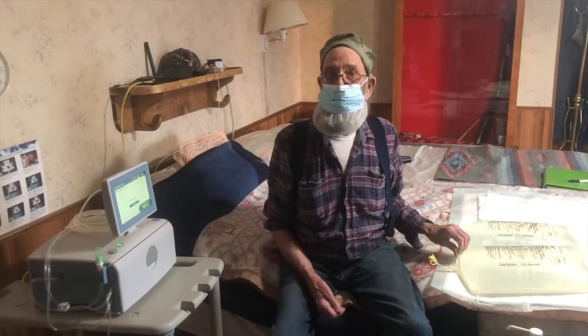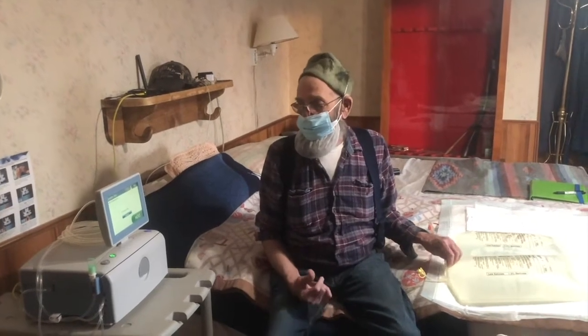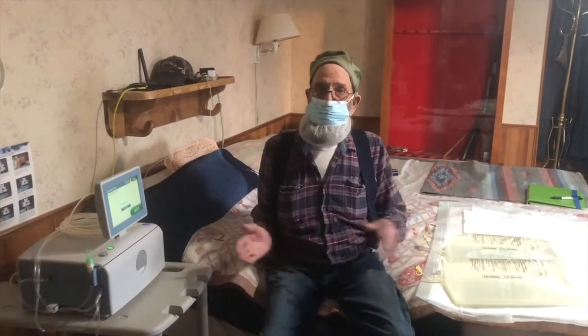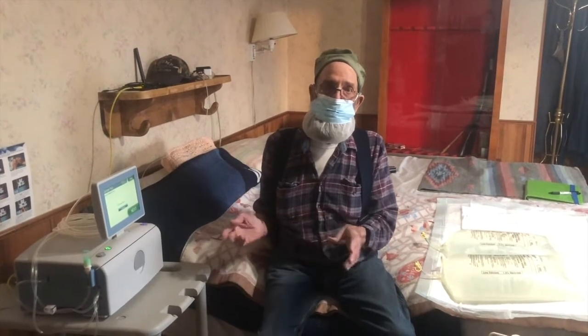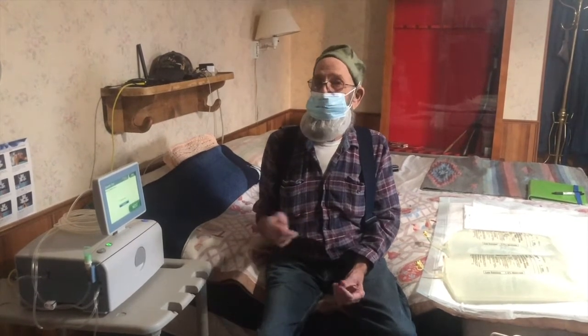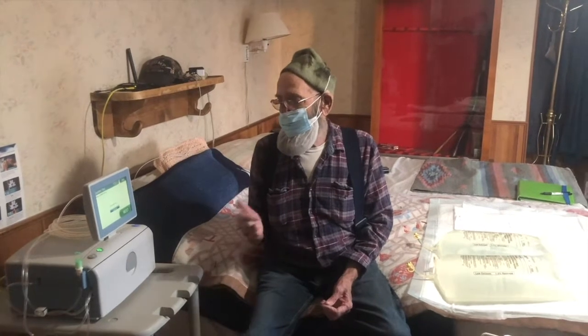The whole treatment takes about 8 hours. I normally come up here about 7 o'clock and get this thing ready to go, let it prime, and then I pause it as soon as it gets everything primed. It takes like 14 minutes, so we wait that 14 minutes.